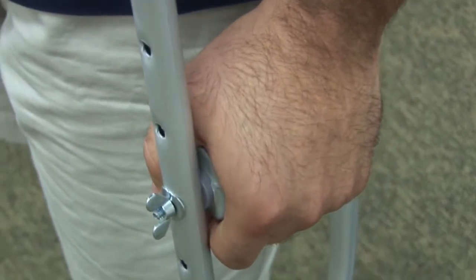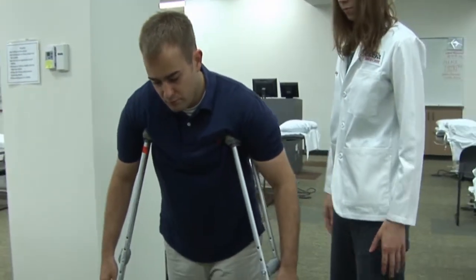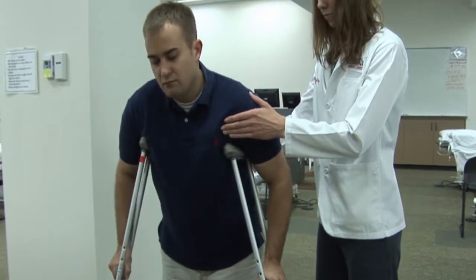It's very important to keep your body upright and push through your hands and arms to lift yourself. Most importantly, avoid resting your body weight on the arm pads so you can prevent nerve injury.